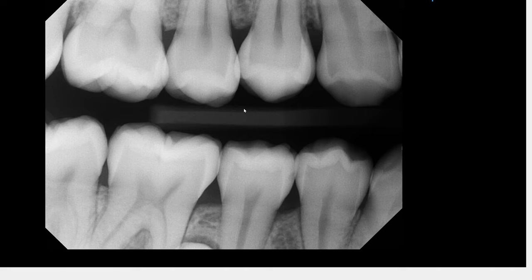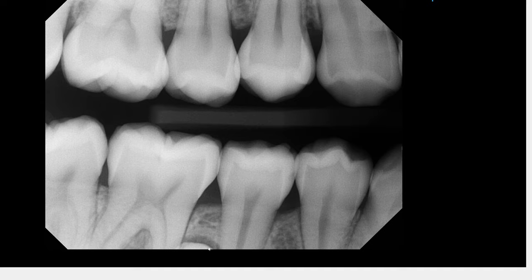Hi everyone, I have a very interesting case to share with you today. Take a look at this premolar bitewing radiograph. As you're evaluating, rather than focusing on open contacts or dental caries, you should be looking within the alveolar process. In the mandibular region, there is a thin radiolucent rim and an opacity right below it — something you should be catching just from bitewing radiographs.